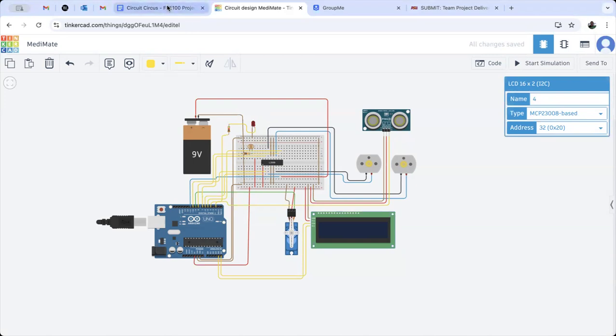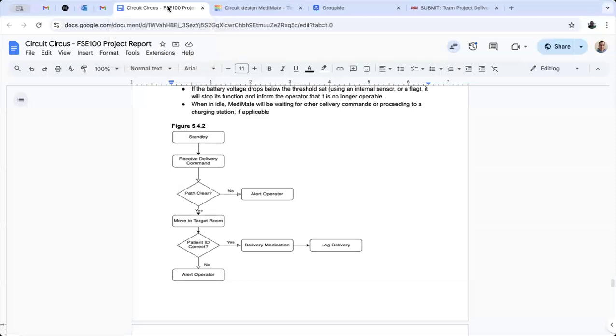And so I want to just show the flow chart for this robot. The robot will be in standby mode. It will receive a delivery command. It will check whether the path is clear, yes or no. If so, it moves to the target room. It will ID the patient, and it will then deliver the medication, then log the delivery. So we're going to have three different commands: deliver, blocked, or alert.